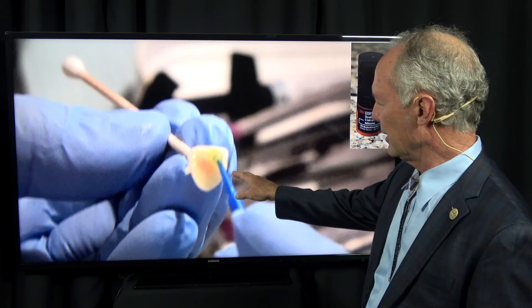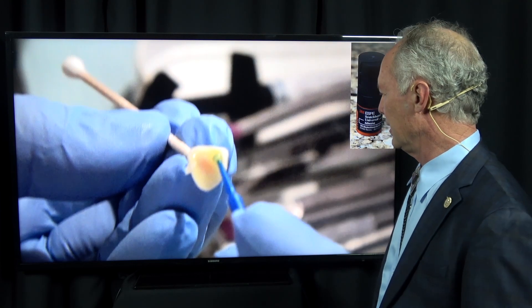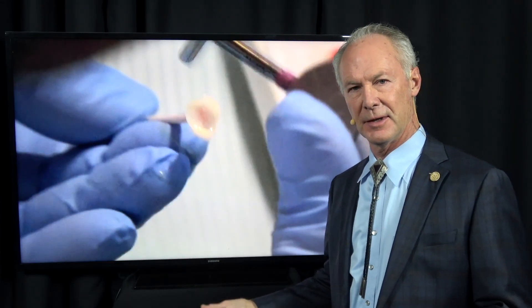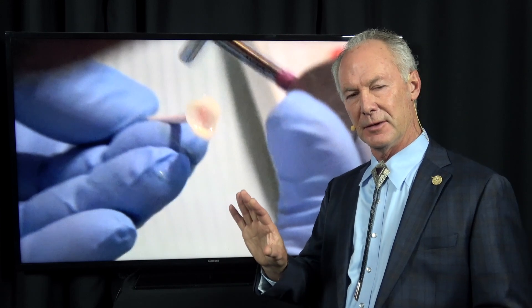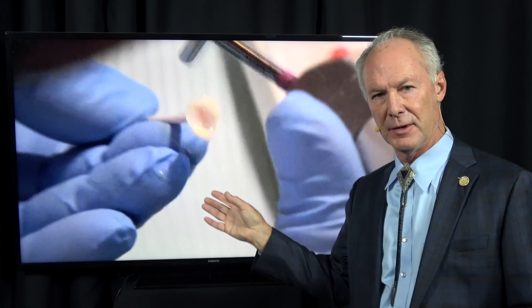I'm placing the primer adhesive on the tooth side of the veneer, and it's very important that you blow it off. Why? Because the primer adhesive has an acetone carrier, and if you leave it on the tooth or veneer in bulk, that acetone can diminish the bond strength. Both with veneers and with direct composites, you always want to blow off the primer adhesive.